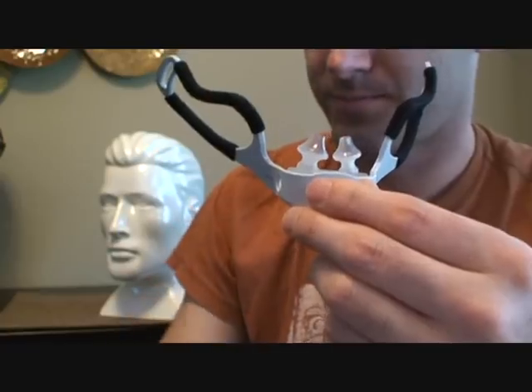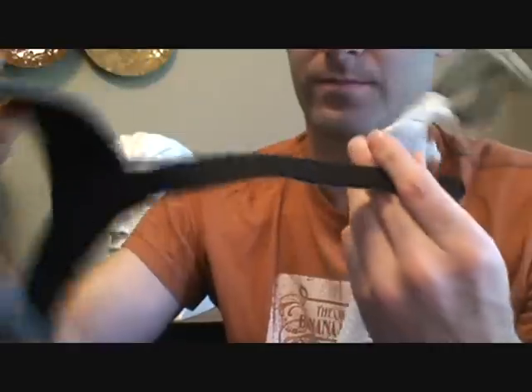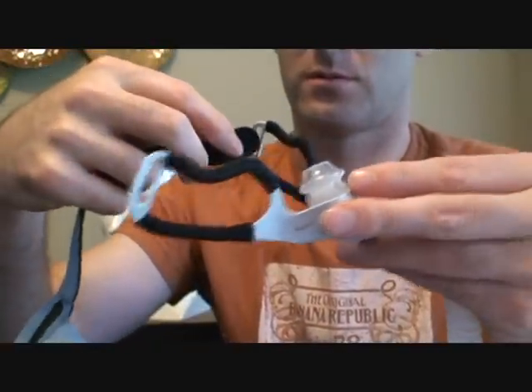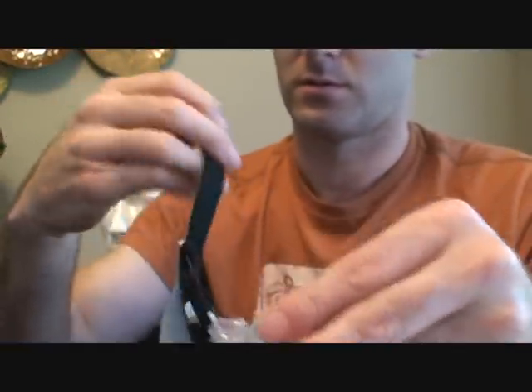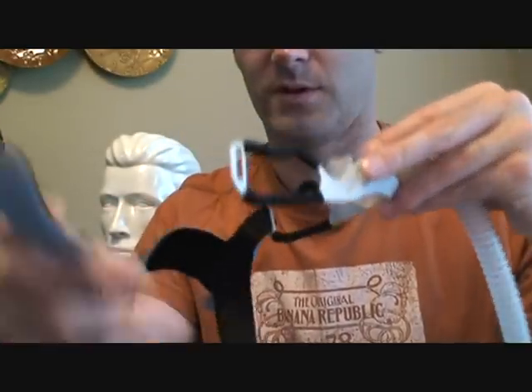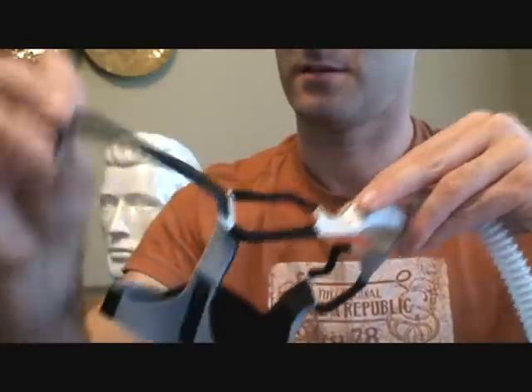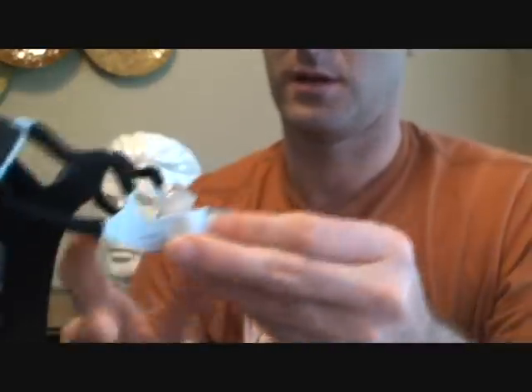Then you have the headgear. The strap here goes on top. You want to feed these through and tighten, then feed this through and tighten. And that's it.